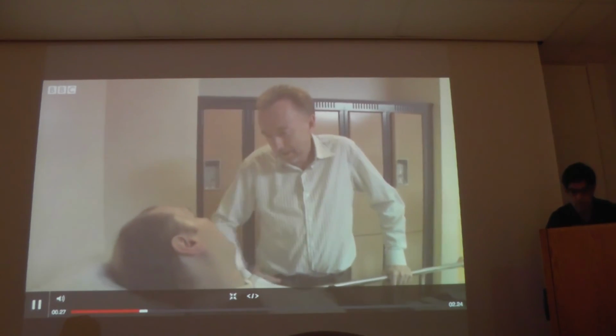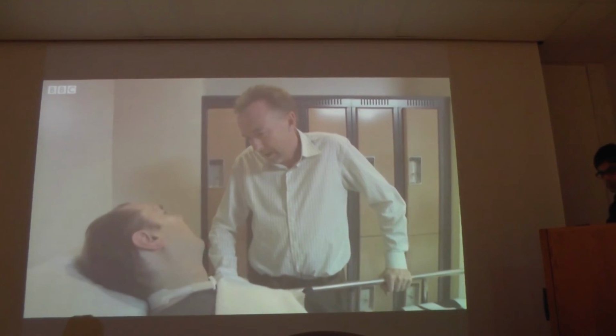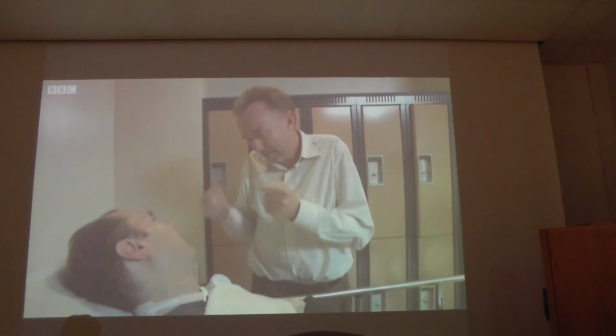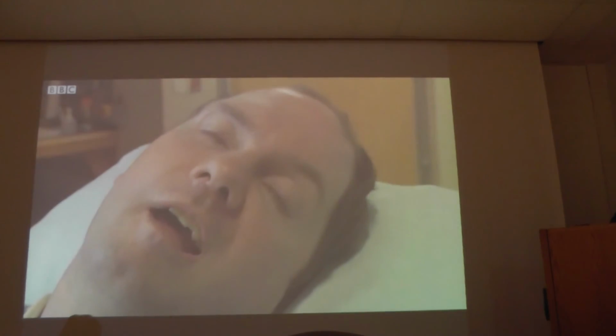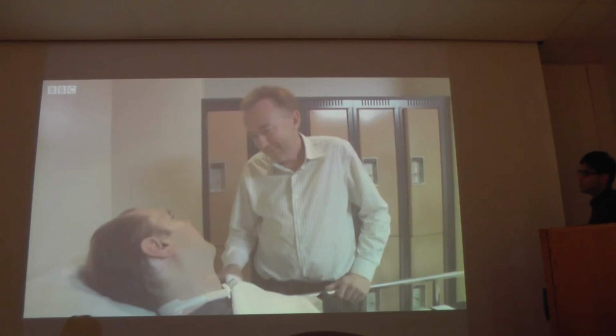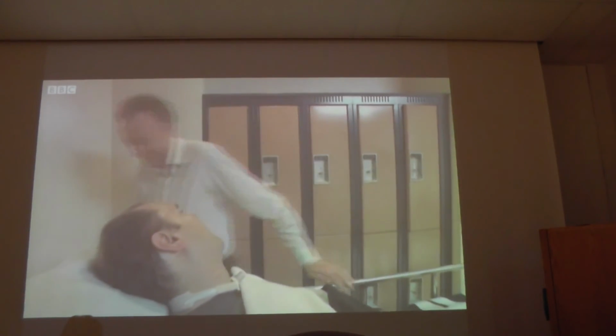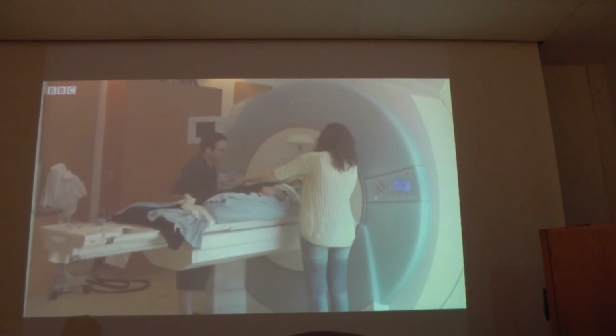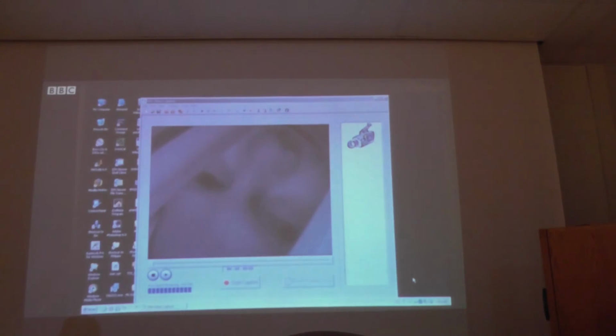Scott's on his way to the University of Western Ontario. Playing tennis quite a few times while you're in the scanner. And if you can do that, then you'll be able to see your brain activating. So I want you to imagine you're standing on a tennis court and moving your arm around as much as you can. Alright, so we're going to put you in the scanner now. Just do your best. Stay awake. Hello, Scott. We're going to try again. We're going to try and get you to imagine playing tennis.